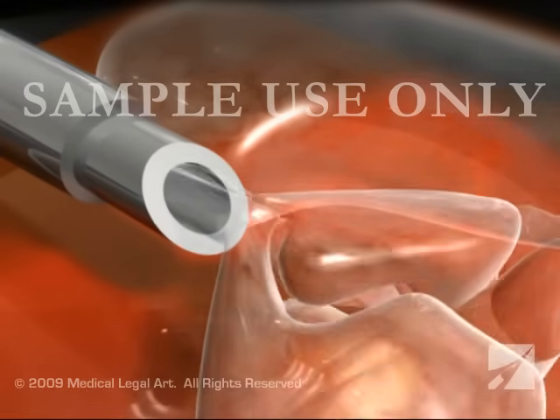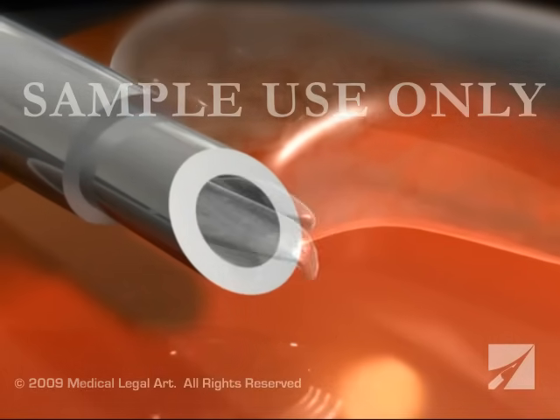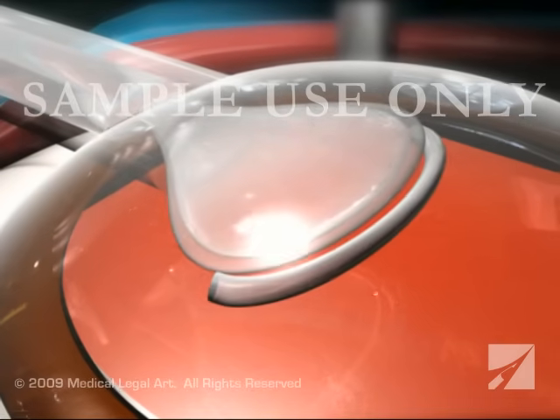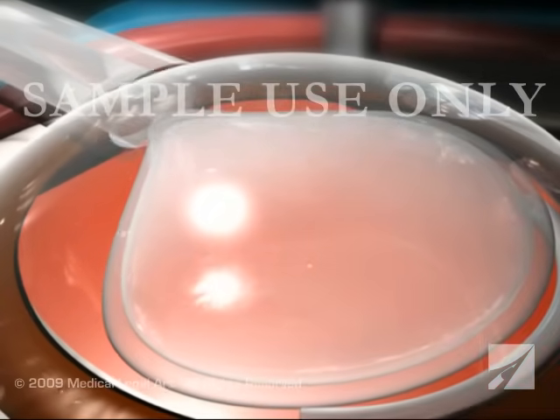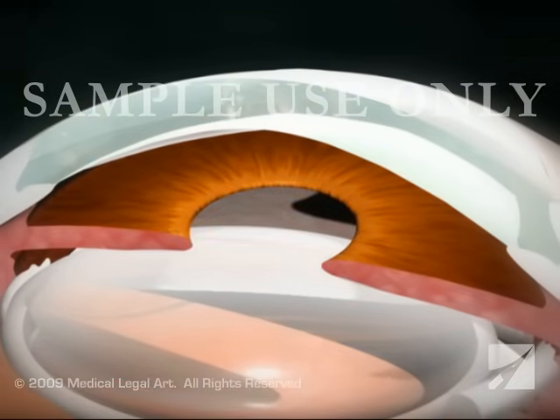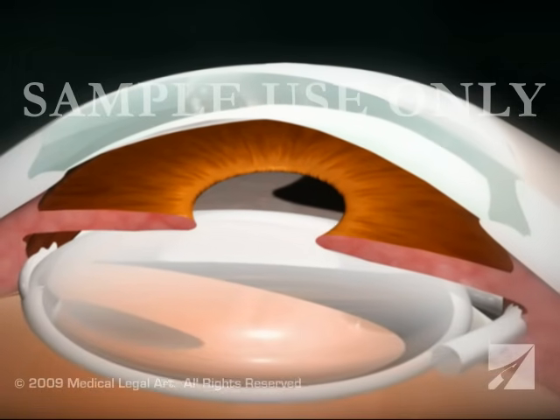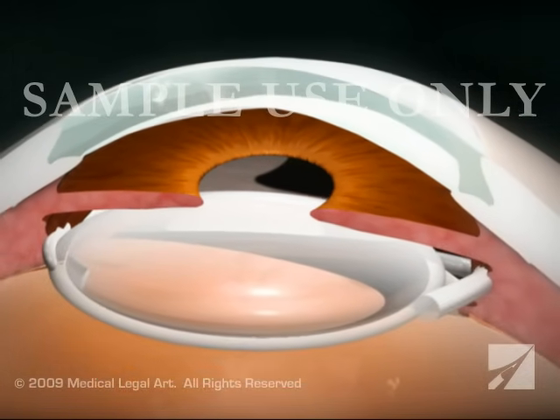These fragments are vacuumed out through the incisions. Then, an artificial intraocular lens is inserted. Intraocular lenses are made of plastic, silicone, or acrylic compounds.